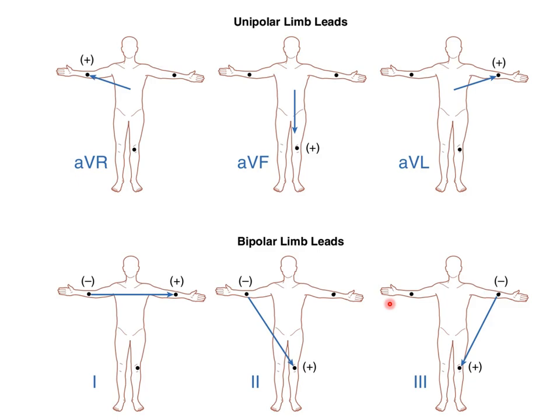So when it projects out to the surface, it's a very blurry picture of what's going on in the heart. Right? You would obviously like to have a huge number of electrodes strapped around the heart itself to see what the exact voltage pattern is on the surface of the heart. But what you've got is the surface of the patient, and that's this projection of those voltages through the tissues onto the surface. It's still a kind of imaging.